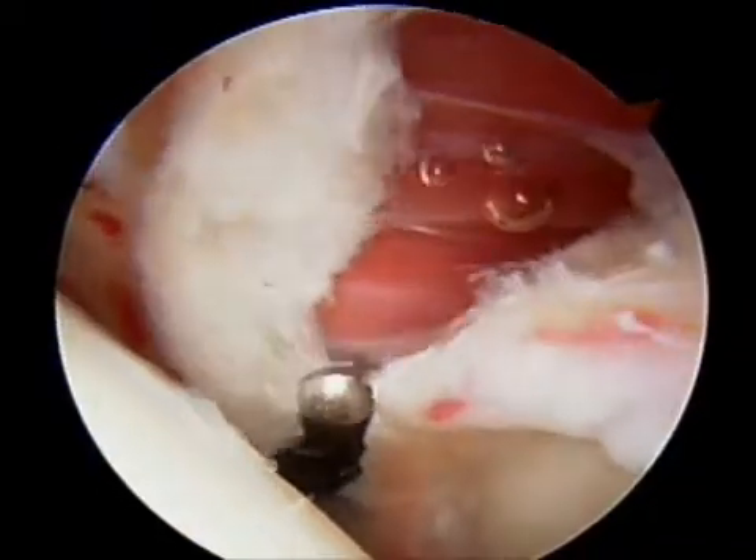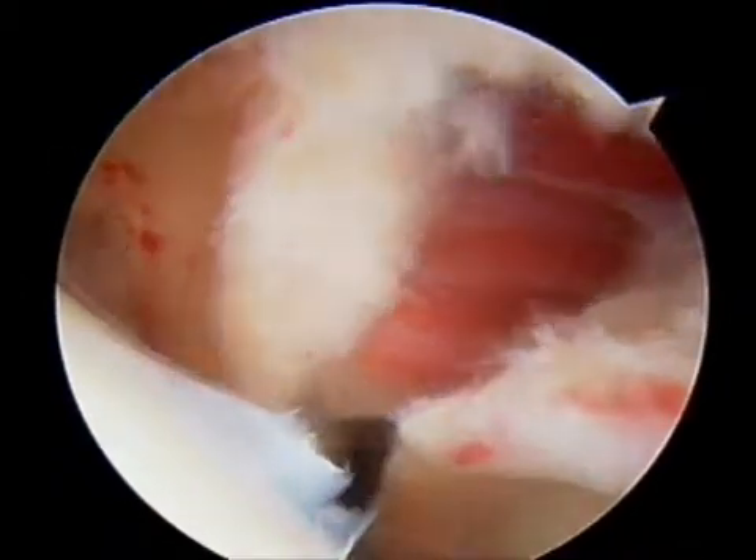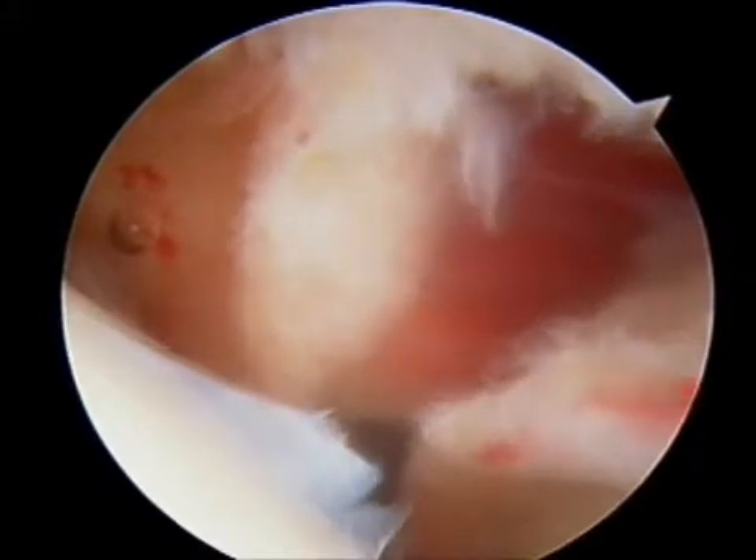This video shows the thickness of the ligaments towards the left side of the screen. The ligaments are normally only one millimeter thick.